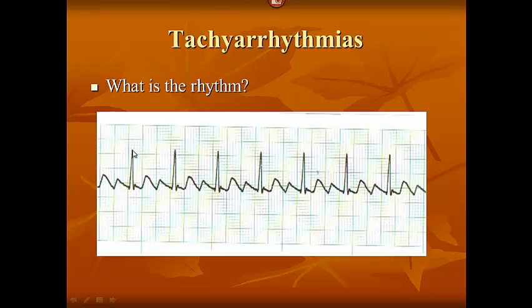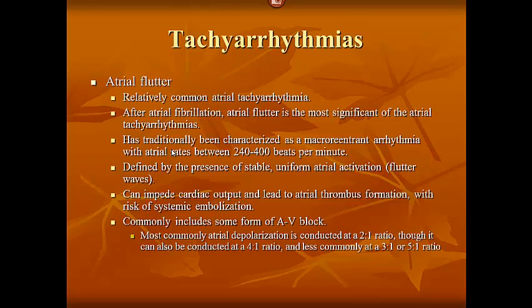Now it tends to be regular between RR intervals. Very common, it is the most significant of the atrial tachycardias and tachyarrhythmias. It is very uniform. As I said, it's regular, but it does impede cardiac output.